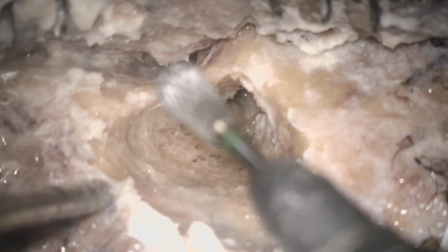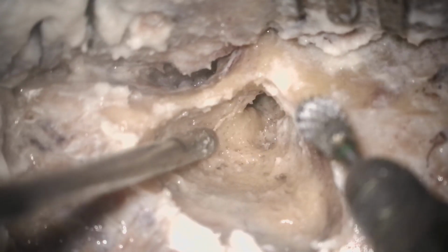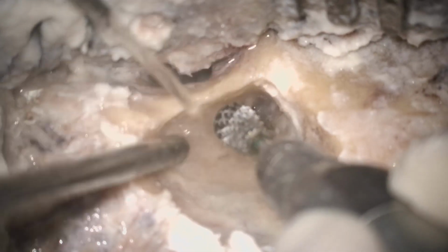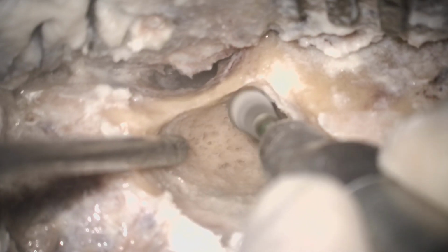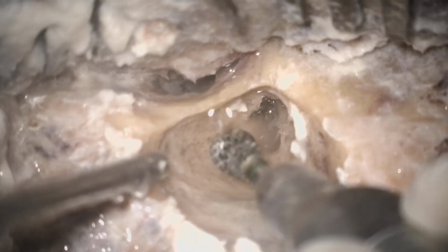Actually, the mic is not properly functioning. That's why we have some problem. Yes. So the color change is definite in the case of the mastoid bone or the sclerotic bone, and the color of the otic capsule. There is a gross difference. So that will help you identify the lateral semicircular canal from the other part of the bone in the mastoid antrum. Okay.